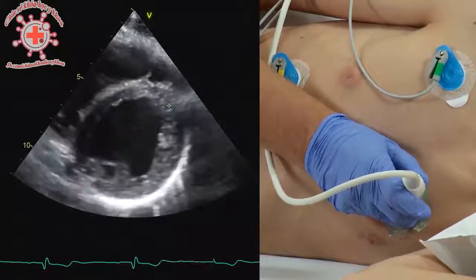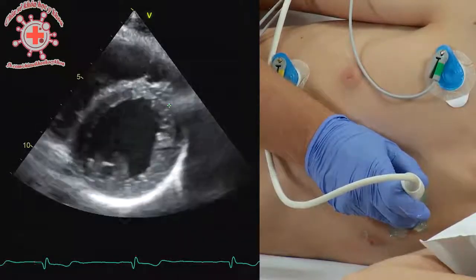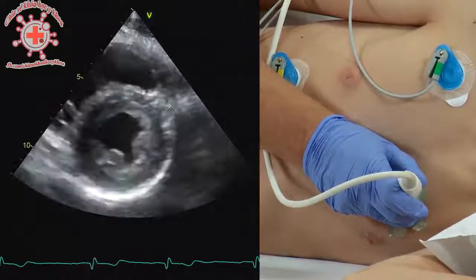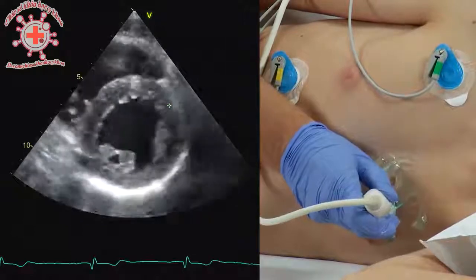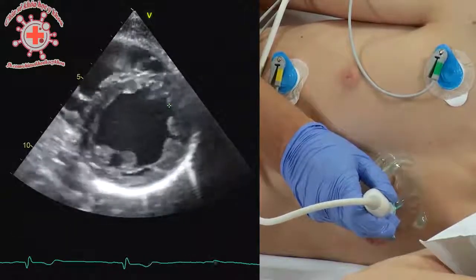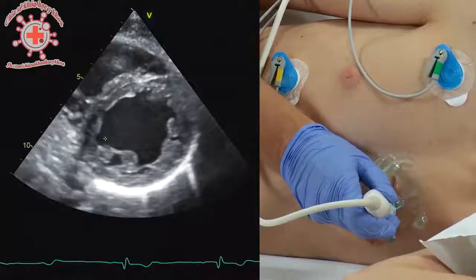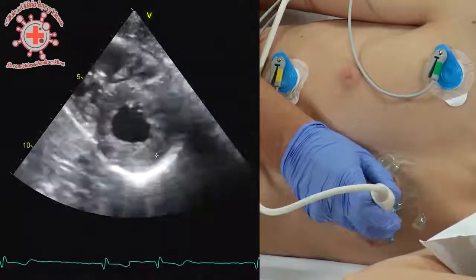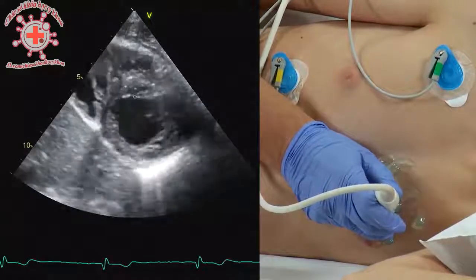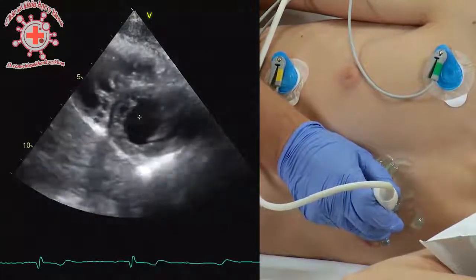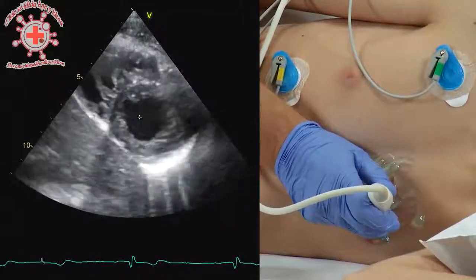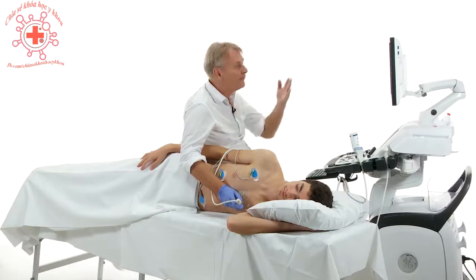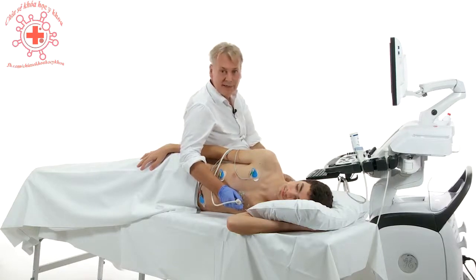You can nicely appreciate the pericardium, which is a very echo-dense structure. Then you tilt downwards and the left ventricle gets smaller and smaller. Sometimes it makes sense to move down one intercostal space to get better image quality. Moving down, the ventricle here is still round — you see the trabeculations very nicely. If you move further down, you will first lose the right ventricle, and the left ventricle gets smaller and smaller. This is what I would perform to sweep through the entire ventricle to appreciate global left ventricular function and detect regional wall motion abnormalities.